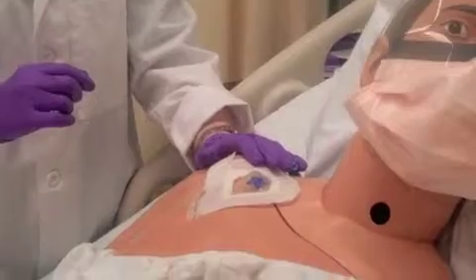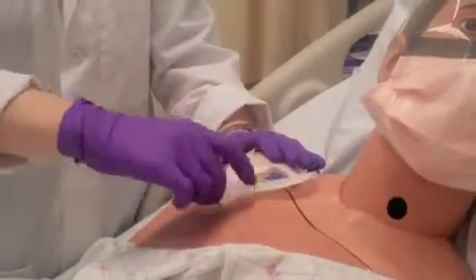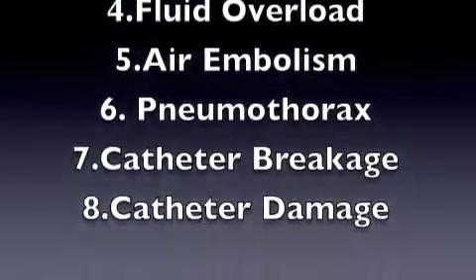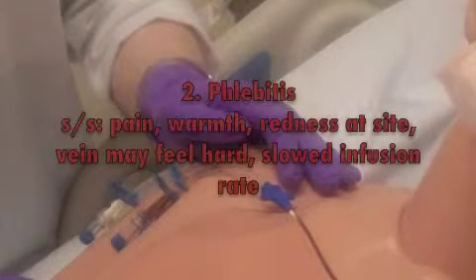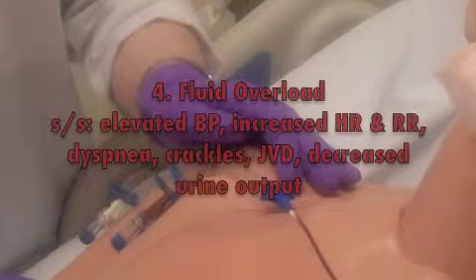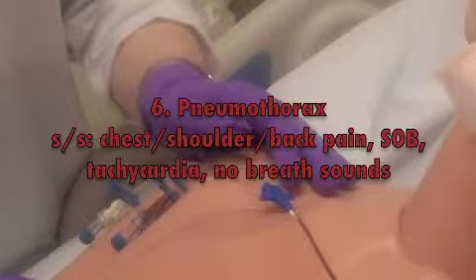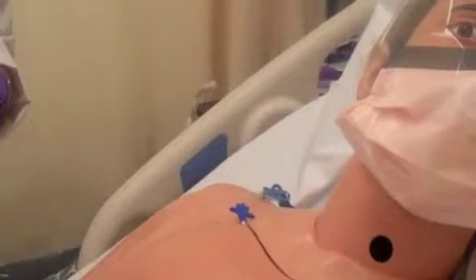It is now time to remove the old dressing. The nurse will visually inspect the insertion site of the catheter for signs of infection, being careful not to touch the site with gloved hand. Now she will remove her clean gloves.